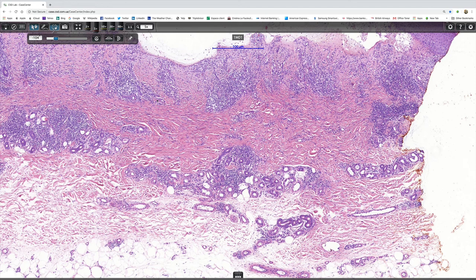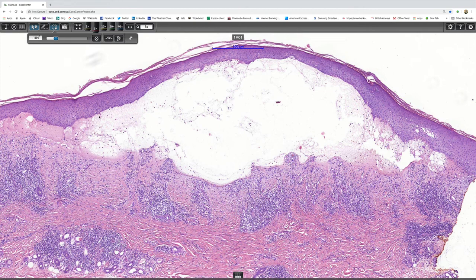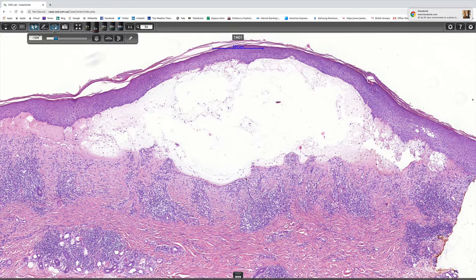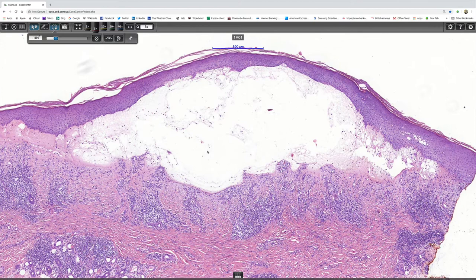Let's look at this at higher magnification — a perfect sub-epidermal blister. The roof is intact. The blister cavity contains a little bit of fibrin and a few inflammatory cells. But the reason I'm showing this to you is because it beautifully demonstrates some residual basement membrane going right the way along the base of the blister cavity and covering the tips of the dermal papillae. You very rarely see that.